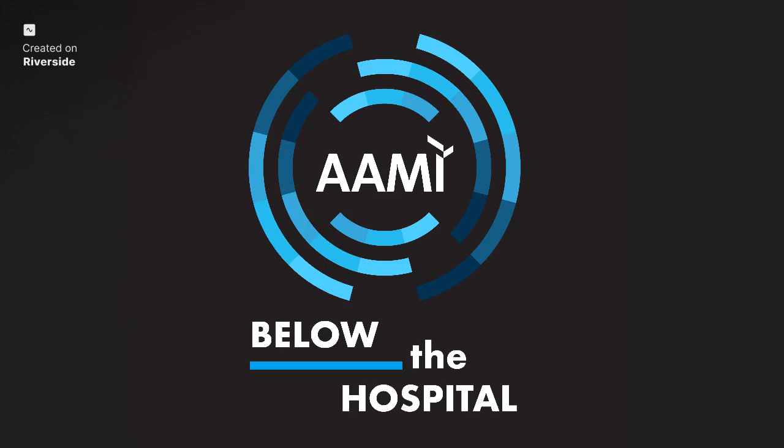For example, standardization of the formatting. Simplifying and standardizing the structure of IFUs across all different devices can really help reduce the confusion. If we have a consistent format with clear sections, a cleaning section, a disinfection section, a sterilization section, depending on, of course, the medical device, it allows the staff to quickly find the necessary information they need in really quick time.